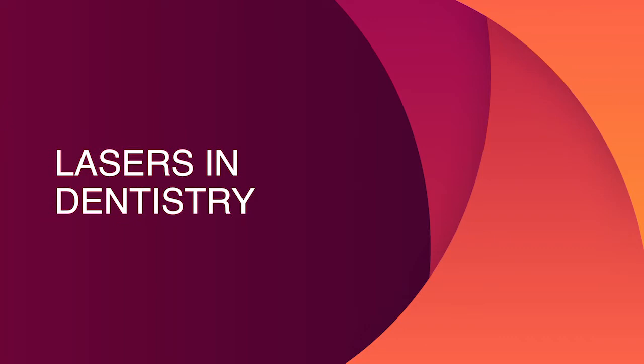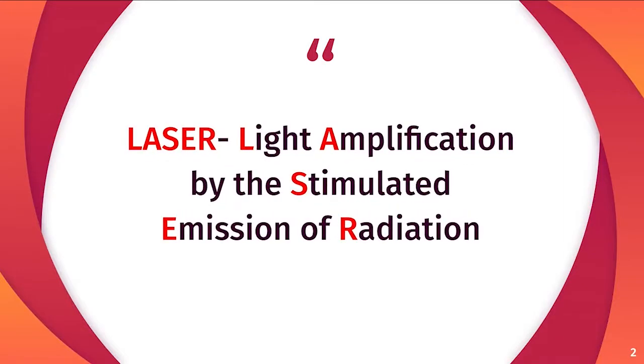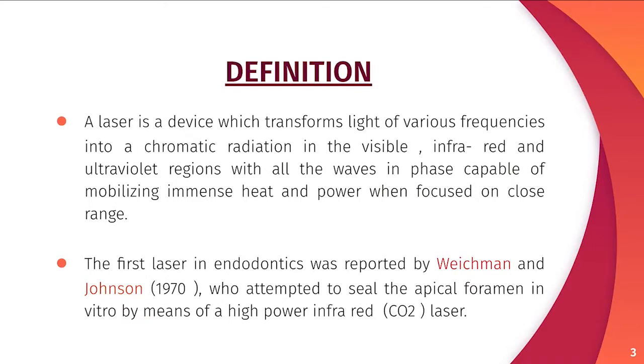In this video, we'll be discussing lasers in dentistry. Laser, as we all know, is light amplification by the stimulated emission of radiation. Here is the definition of lasers. It is a device which transforms light to chromatic radiation, and this chromatic radiation includes three spectra: visible, infrared and UV region.